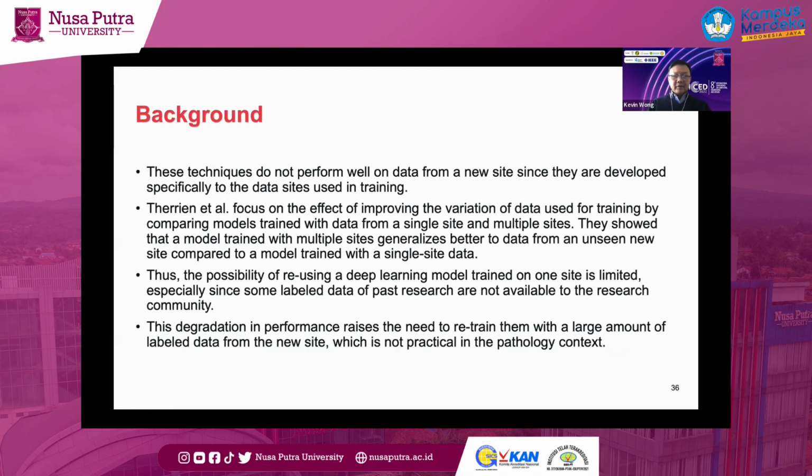So the hypothesis here is, if we have limited data from different sites, and we only train on the data from one site, then build the model and want to pass the model to another site, what can we do? That's why transfer learning is being considered, because we don't want them to retrain at the new site with a large amount of data. As I mentioned, in different sites there are always these limitations of data.